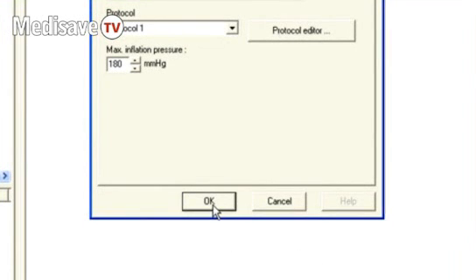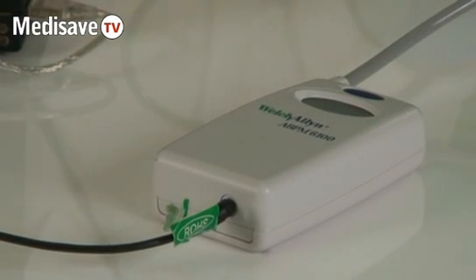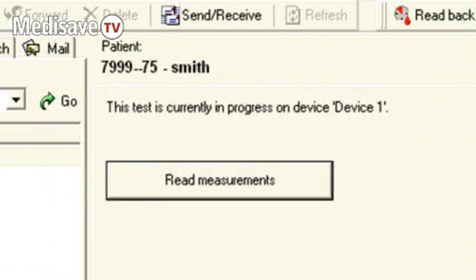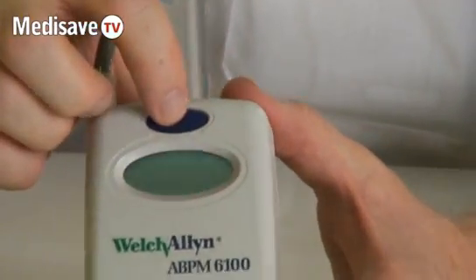So when you're happy with the setup, you click OK and all the details are sent from the PC to your unit. At that point, the test, as far as the machine is concerned, is in progress. You disconnect it from the USB cable, and then while the patient is still in the surgery, you give them a test which will be shown on the display screen on the front of the ABPM.